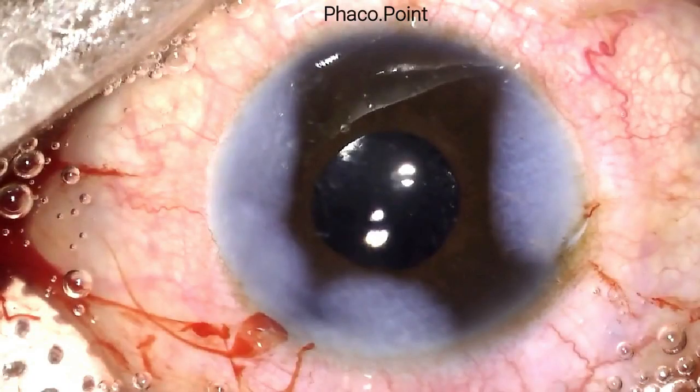This is the end result: a stable three-piece IOL in the ciliary sulcus, with no extension of the anterior capsular tear into the posterior capsule — thereby avoiding any compromise of the posterior capsule and achieving an uneventful outcome.